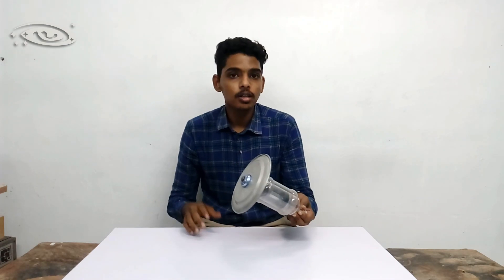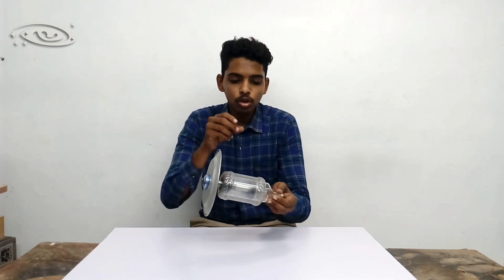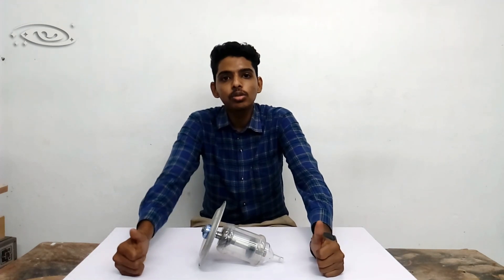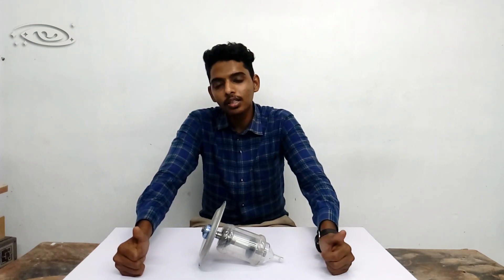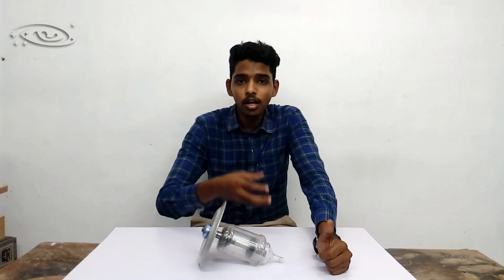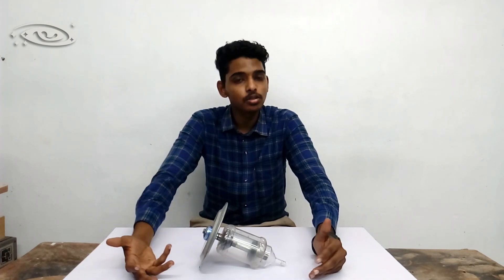This rotating anode rotates at the rate of 10,000 revolutions per minute. Due to this high speed rotation, there is enormous heat production inside the bearings. To lubricate the bearings, metallic lubricants are used. The reason oil is not used is that due to high speed rotation and enormous heat, the oil may vaporize and spoil the vacuum. If the vacuum is spoiled, electron emission and X-ray intensity are reduced and tube life is shortened. After many experiments, metallic lubricant was found to be suitable for these bearings as it does not vaporize at high temperatures.